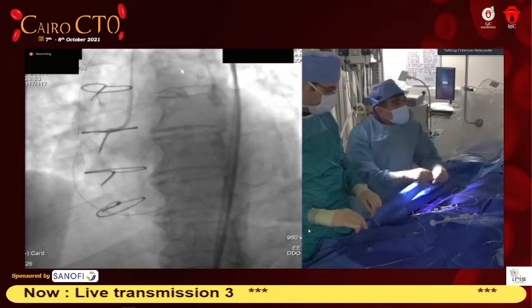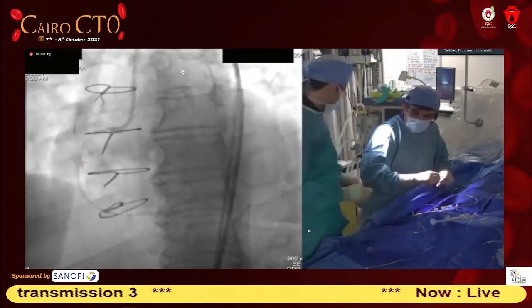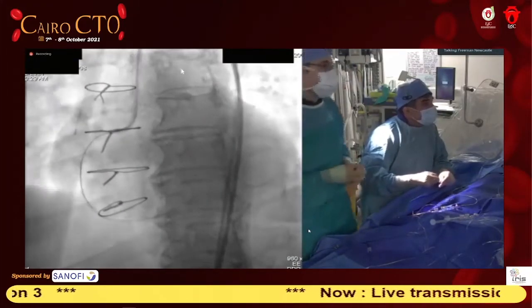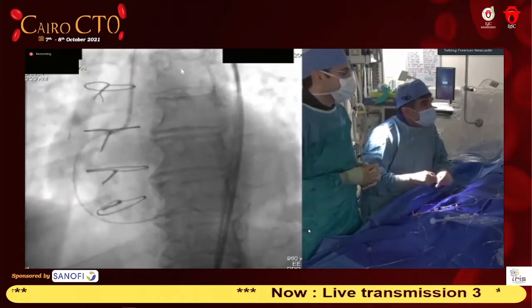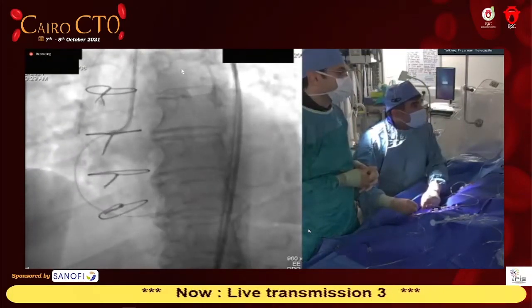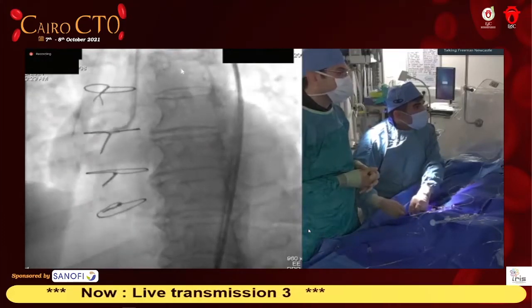And of course, sometimes that happens when you're taking your microcatheters out because you squeeze the heart and it becomes like a shoestring. Important to make sure that, so we'll put this wire down and we'll move the guide catheter or microcatheter, so there's some blood flowing. Here we go.